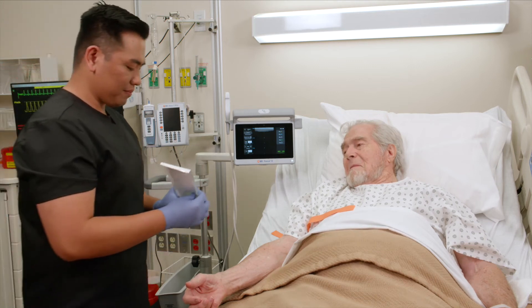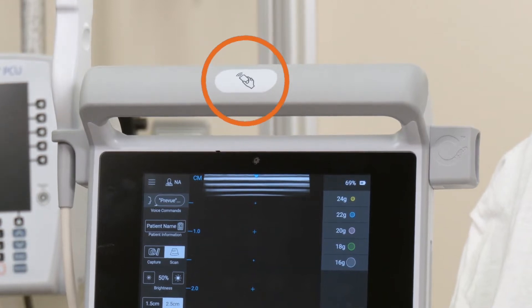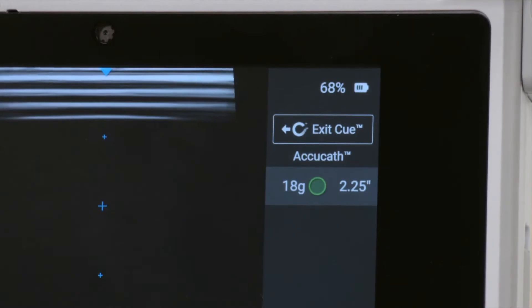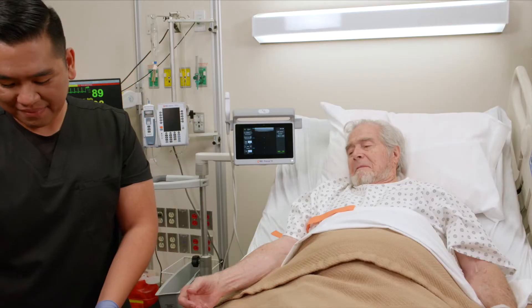To use Q-needle tracking technology, first scan the RFID tag on the catheter into the ultrasound. Align the RFID tag with the scanned symbol on the system handle. Please contact your local rep for available Q-compatible devices.